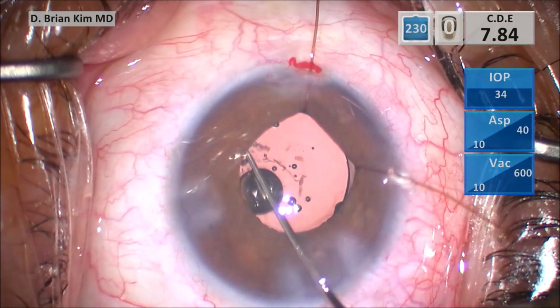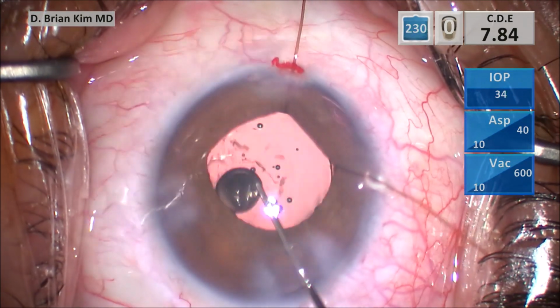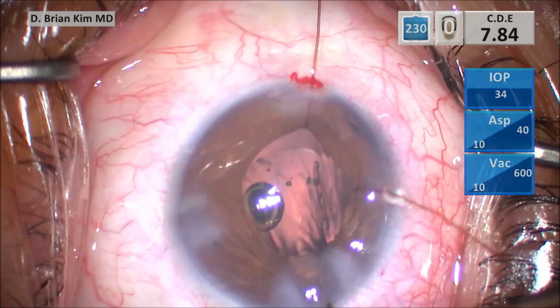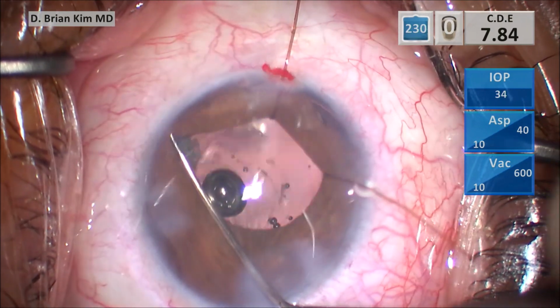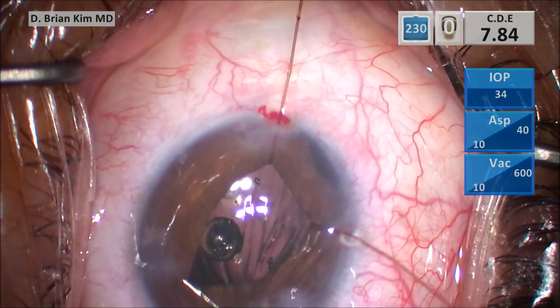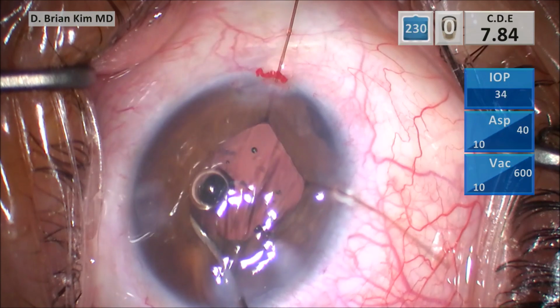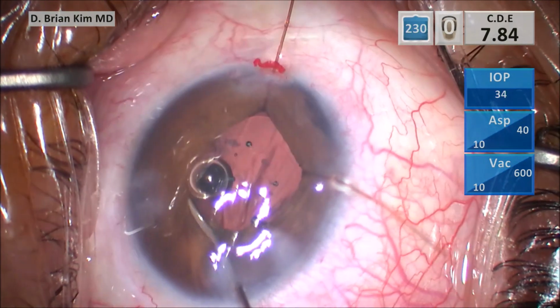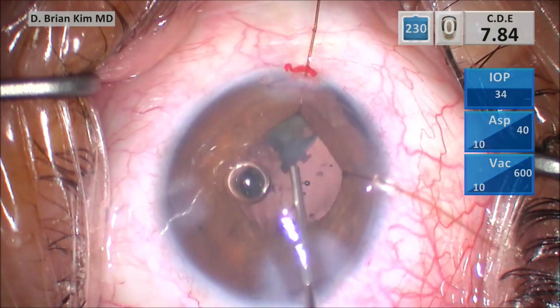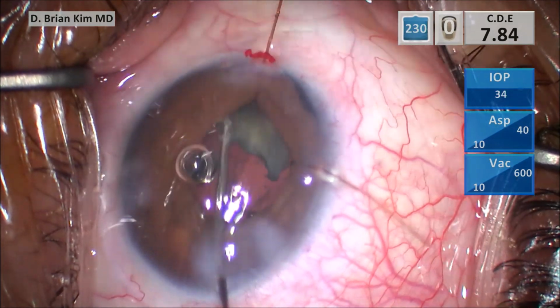into the bag. And now that I have the Lester, I'm going to start to look around, and lo and behold, there's that nucleus. It's actually on the left side. You can see it right there. And so since I had the Lester, I knew that I was going to get to it later. Since I had the right instrument, meaning the Lester, I was able to identify the piece of endonucleus that was hiding, and now I switched that Lester out for a viscoelastic cannula.